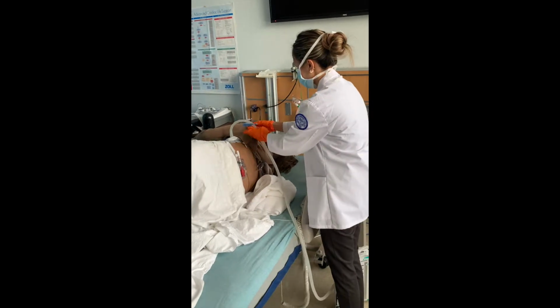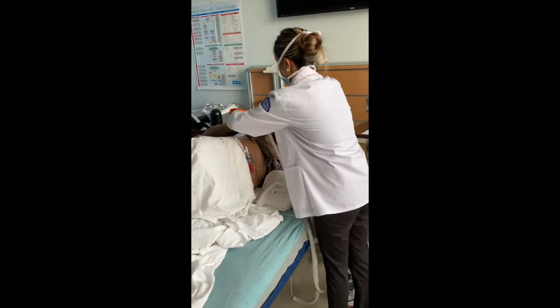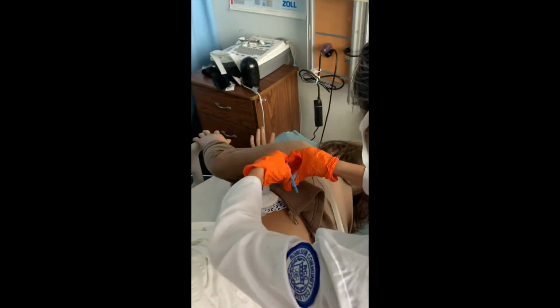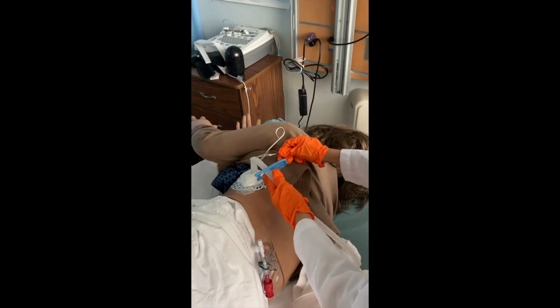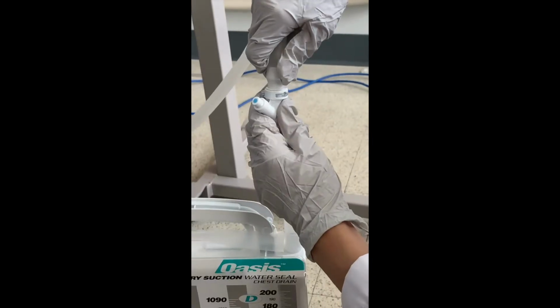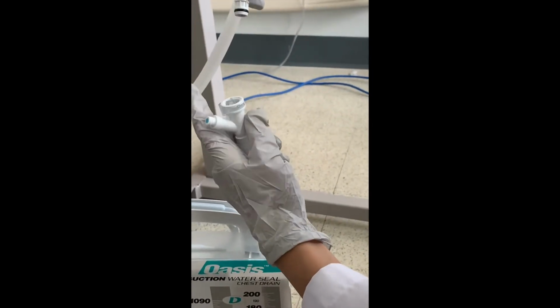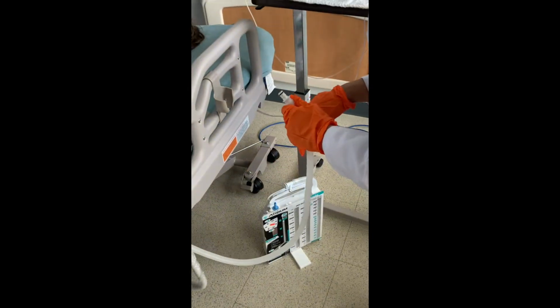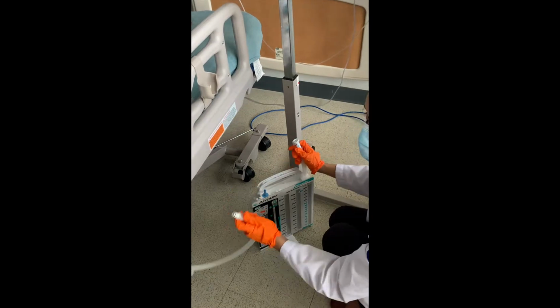Clamp the chest tube near the insertion site. Disconnect the chest tube joint from the tubing. Reconnect the chest tubing to the new drainage system.